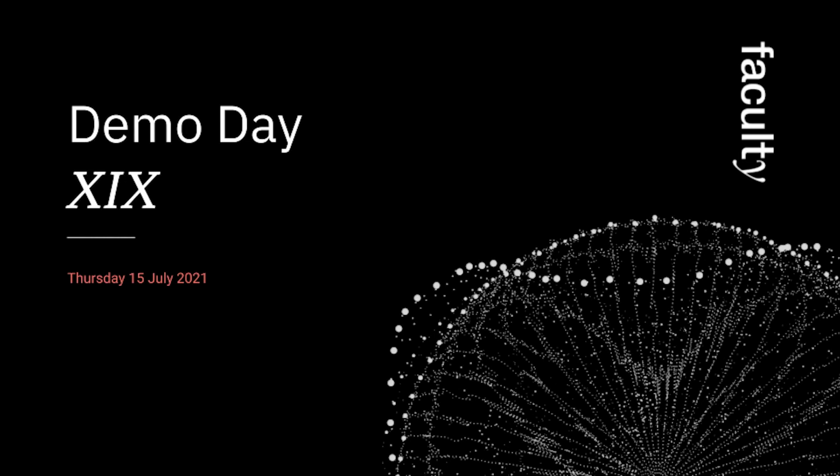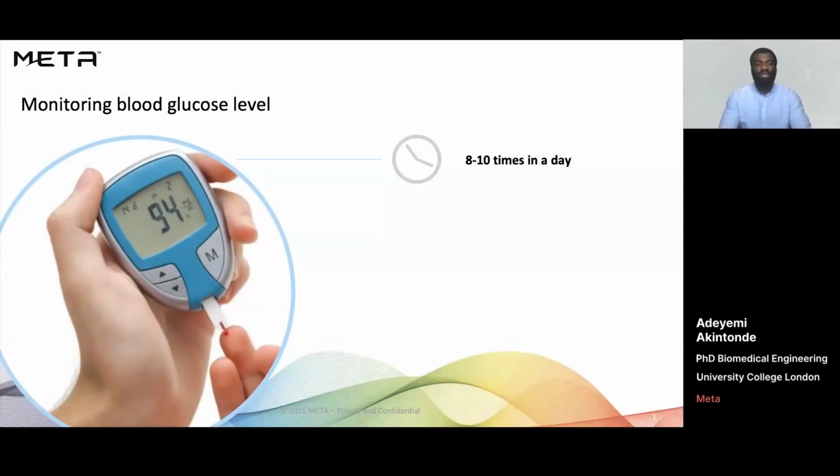Most people affected by diabetes are required to monitor their blood glucose level. This normally involves drawing blood from the person's body. Even more scary, you're required to do this between 8 to 10 times in a day. And this is quite an invasive approach. So as you can imagine, you can surely appreciate the level of stress that's involved. And as a result, this can affect someone's well-being. It can affect the way you live your life.